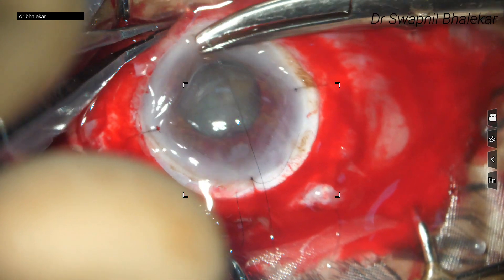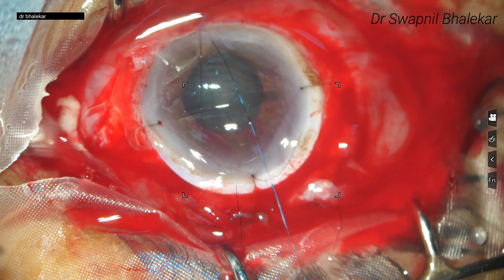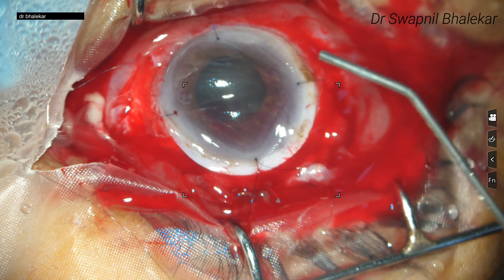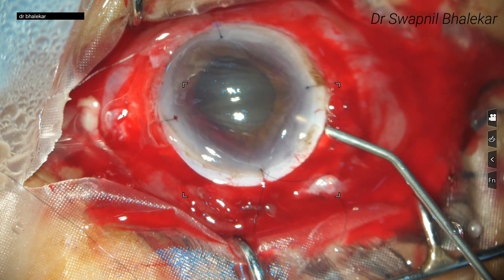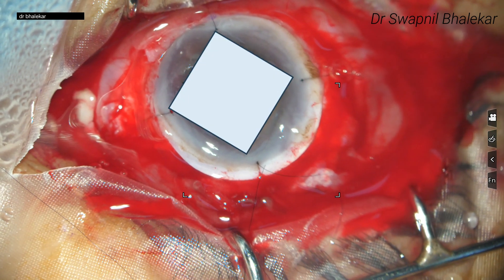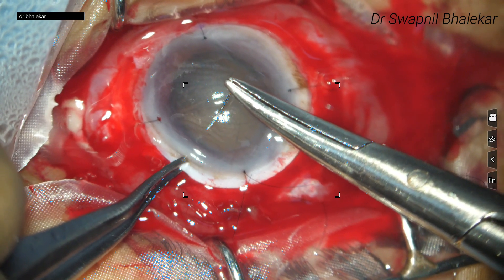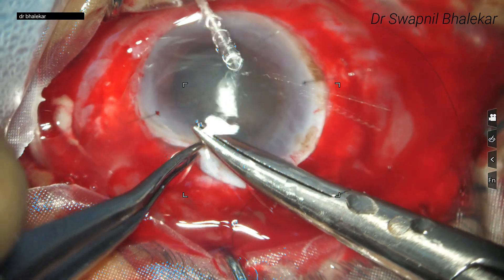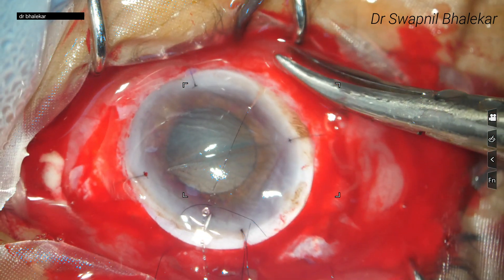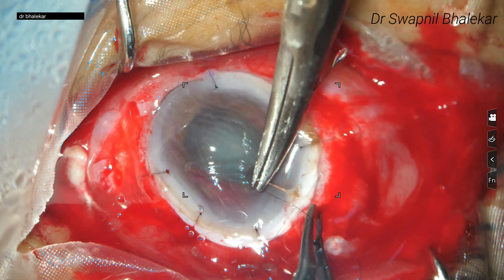Here you can see I am revising the inferior suture and placing it correctly. We have completed our first four sutures. You can inject viscoelastic to form the anterior chamber after four sutures. If these sutures are well positioned, they will form a square shape in the center, indicating that your sutures are rightly placed and you can go ahead and place the next sutures. Next we will continue with additional sutures. It's important to ensure that each suture is placed evenly in terms of depth, length, and tightness. Despite the challenge posed by bleeding, try for precision in your suturing.